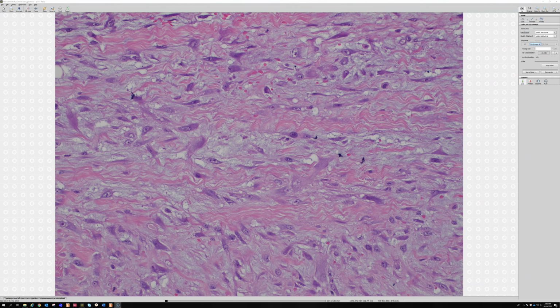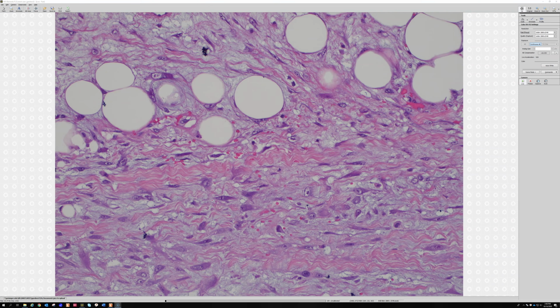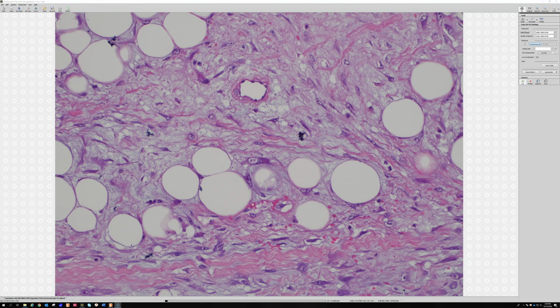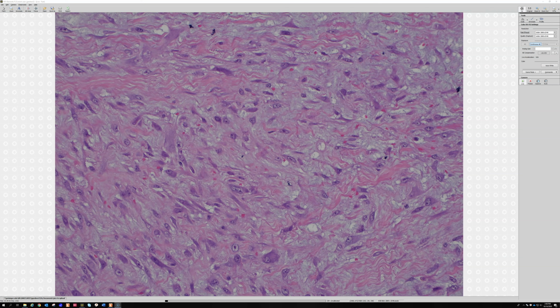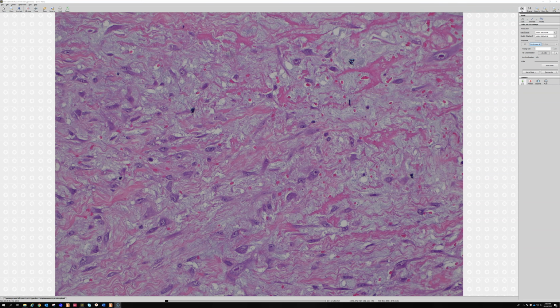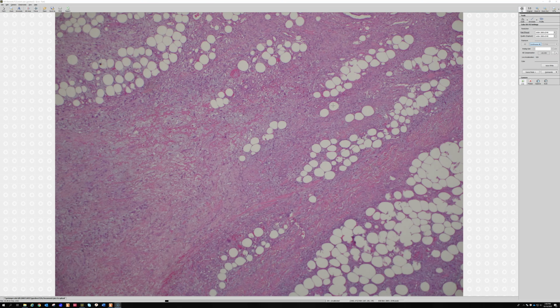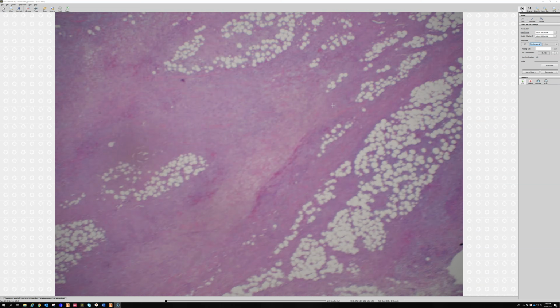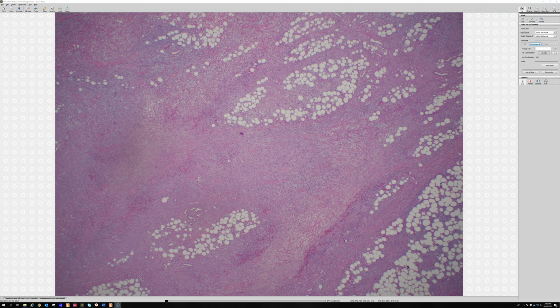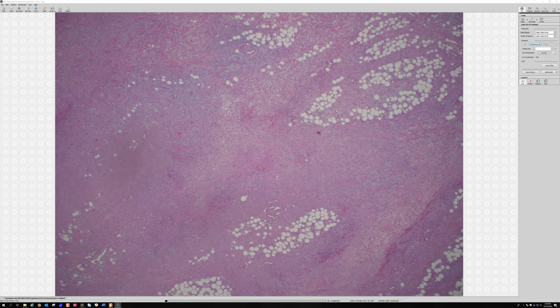And we've got background myxoid change, and we've got extravasated red cells. If I took those big cells out and just showed you this, it looks like nodular fasciitis. Take away the big ganglion-like cells, and this is another form of fasciitis. Very scary, right? It looks like it's infiltrative and replacing the fat. But this is one where we've got stuff at the periphery that looks like fasciitis.